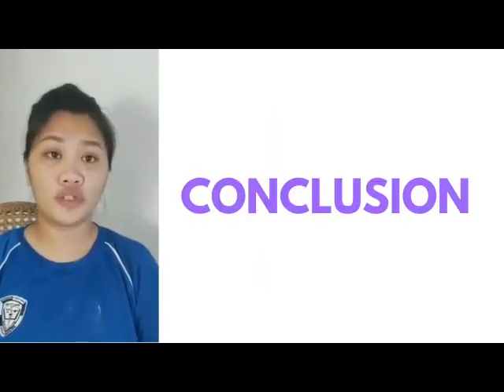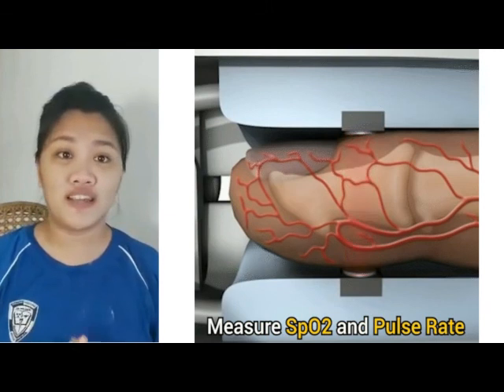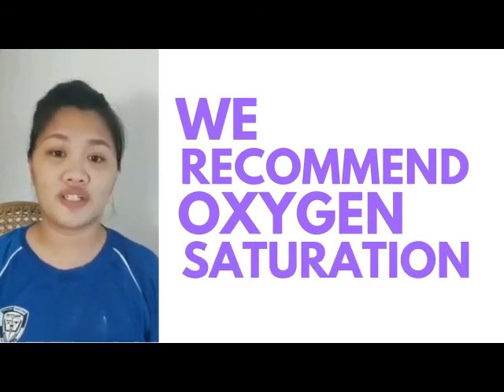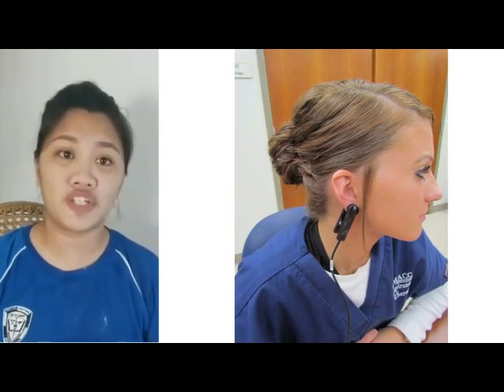Conclusion: we have noticed a possible underestimation of saturation as measured at the fingertip in CF patients with marked digital clubbing. We recommend that oxygen saturation should be measured by transmission pulse oximetry with a multi-site ear sensor in patients with digital clubbing.